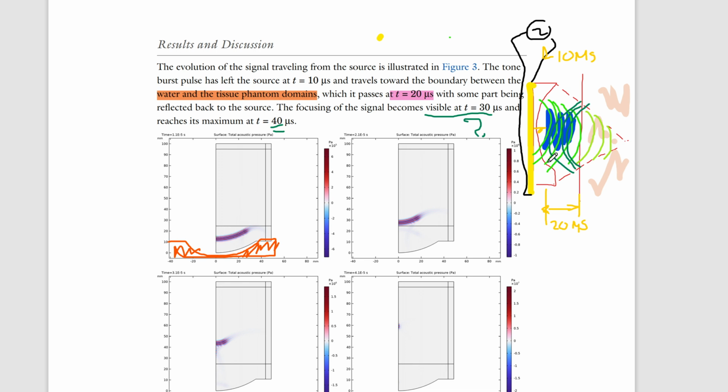And as you saw, when I drew it here, I simplified it and showed one single beam, as if it was non-focused almost. And you can see here, this is the beam shape. It's actually not this shape. We're getting a shape like that. It's different. It looks like we're drawing close. I'm going to assume that what we're caring about is the darkest portion of this, because this actually has met the boundary. And we have this moving upwards towards the boundary.